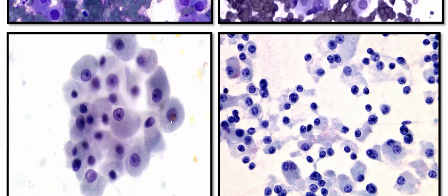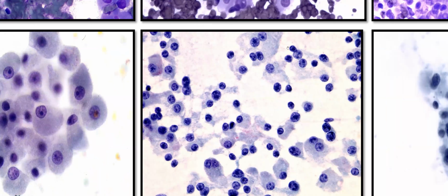When you look on cytology, this is a Pap stained slide, which is an alcohol fixed smear. Again, you see sharp cytoplasmic borders, beautiful round nucleus, and prominent nucleoli. They can be cohesive, they can be single cells, binucleated cells, and sometimes they can lose their cytoplasm and can mimic lymphocytes. I will advise you for those single cells to look at the chromatin, and this is not the chromatin of a lymphocyte.